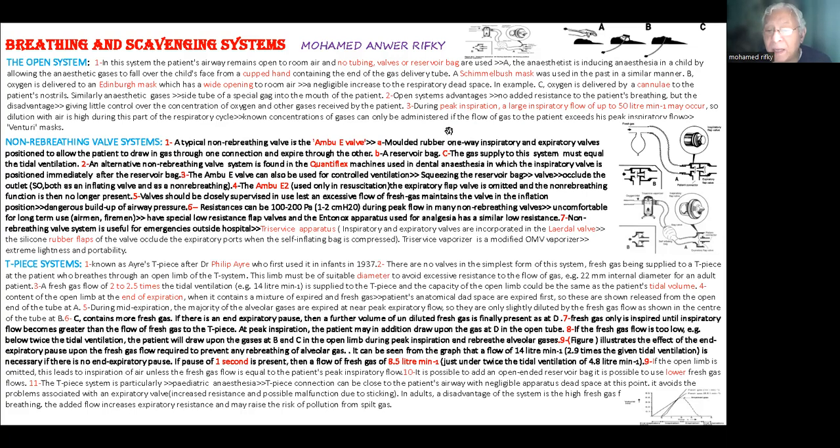Of course, as a solution we can support it with a Venturi mask to increase the flow, to give what we call the peak inspiratory required flow.